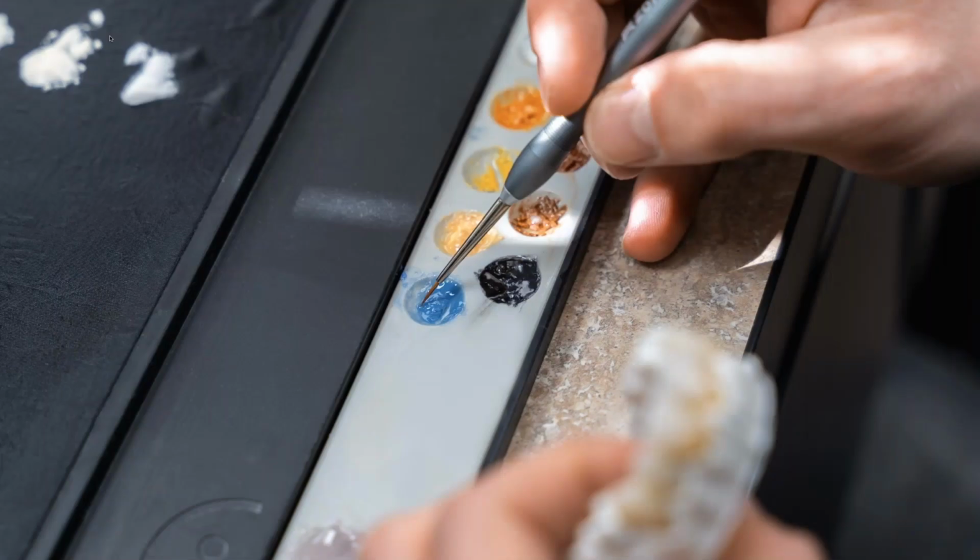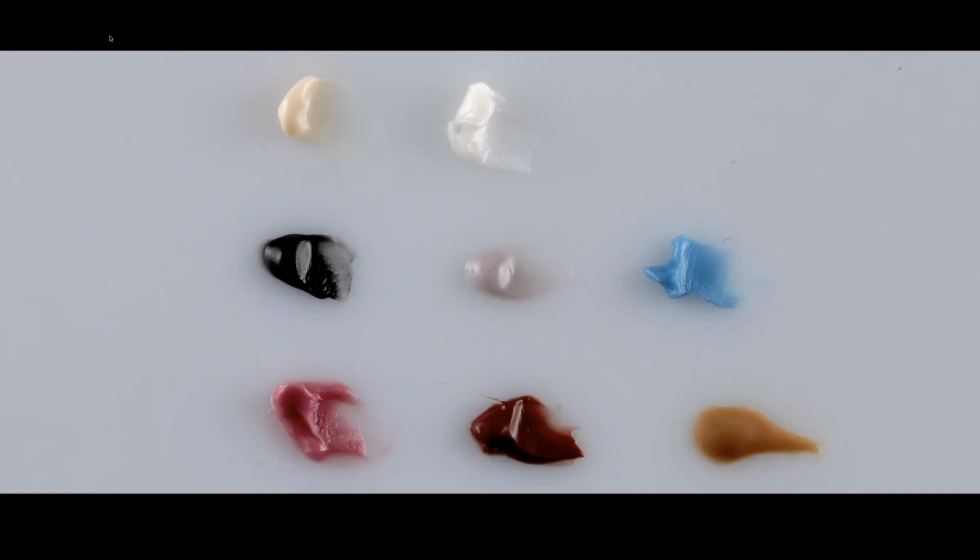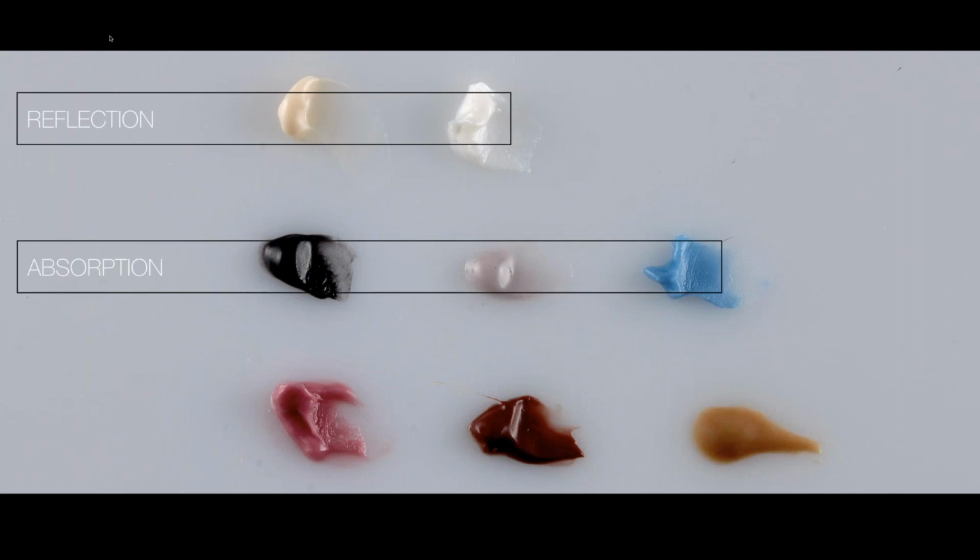So when we start with shading, we have to keep these 2 things in mind. First, less is more, so don't use too much color. And second, with a small amount of color, create contrast. So these are the colors that we use most frequently for staining our zirconia. Reflective colors are used next to absorbing colors, which need to be in small amount so that the restoration doesn't end up looking too dirty or smudgy. This is how we get contrast and illusion of transparency.